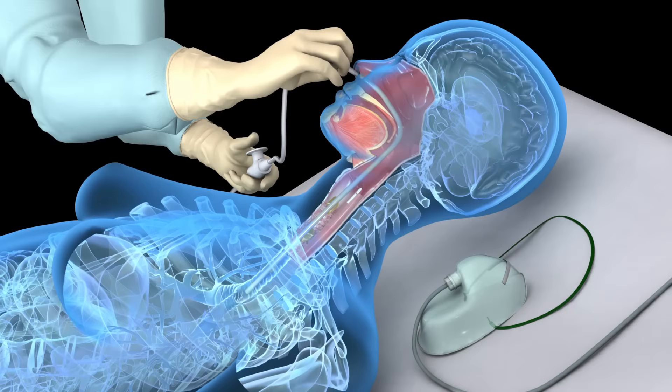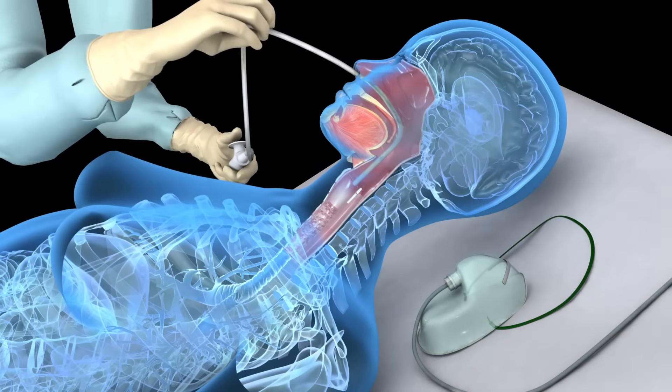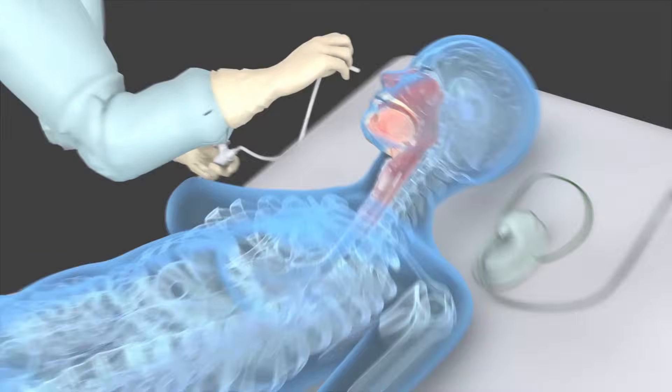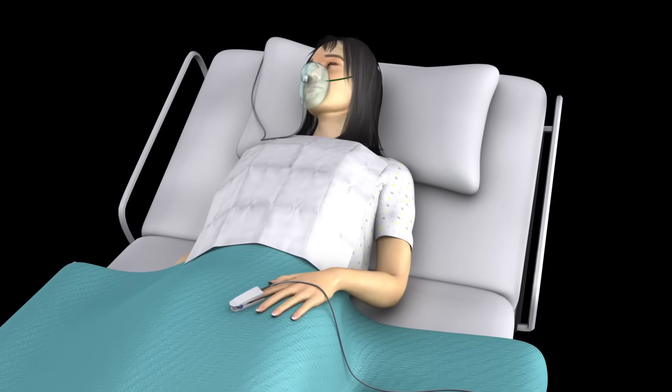Apply suction while withdrawing the catheter. Limit the suction attempt to no more than 15 seconds.